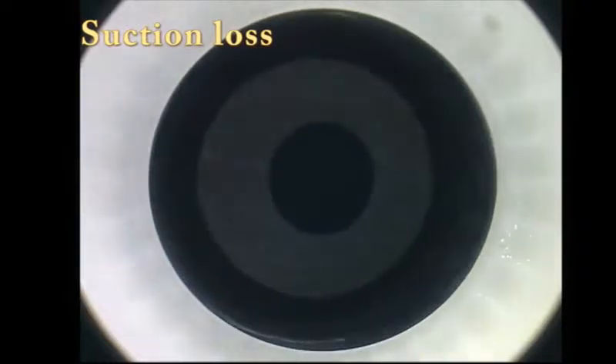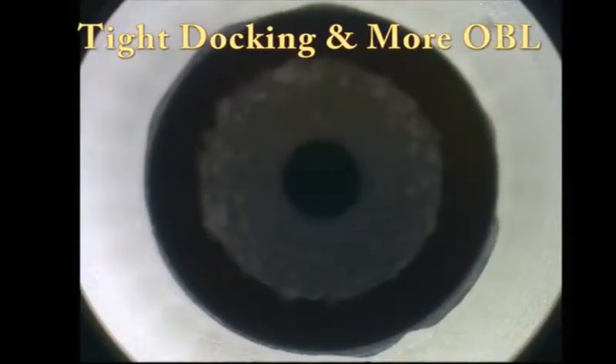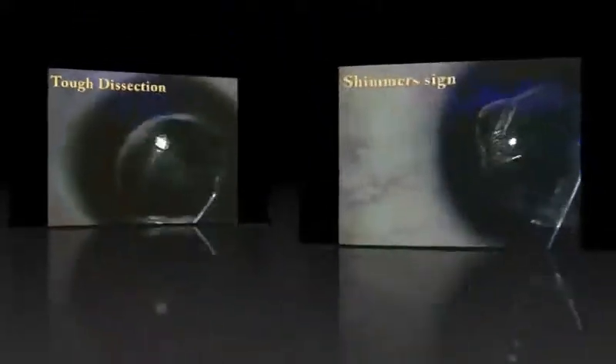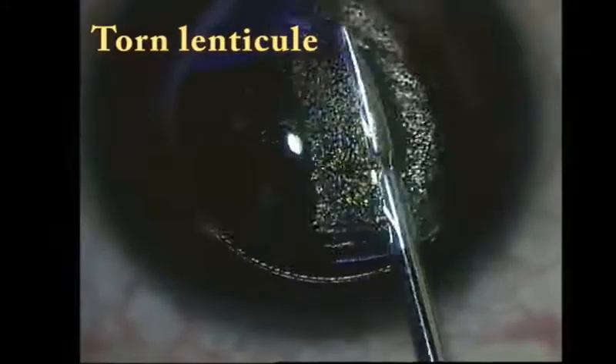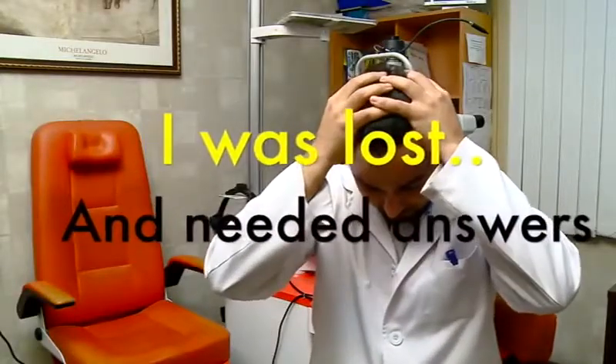In my first case, I had a loss of suction. I had difficulties in dissection due to various opaque bubble layer patterns. Dissection was extremely difficult at times and finding the correct plane of dissection was not all that easy. I encountered torn lenticules as well as cap tears. Once again, I was lost in all the questions.